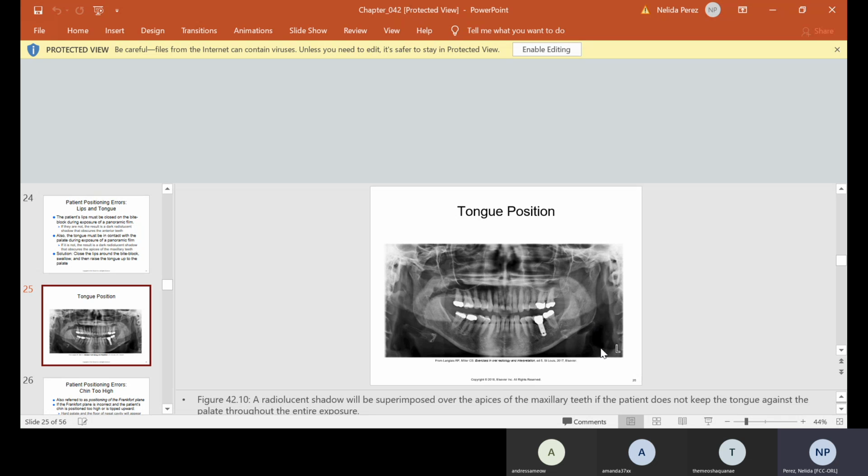So again, we're recognizing off the bat, I can tell you all the wisdom teeth are missing. And then if we have an implant here, then that means that tooth is missing too. So we know 1, 16, we drop down to 17, and we know this is the left side because it has the letter L. Here's 18, so that means 19 is missing too. Coming around on the other side, 32 is missing. So right away, these are the things that you guys need to identify. The teeth that are missing, there's implants, there's crowns, and there's fillings.